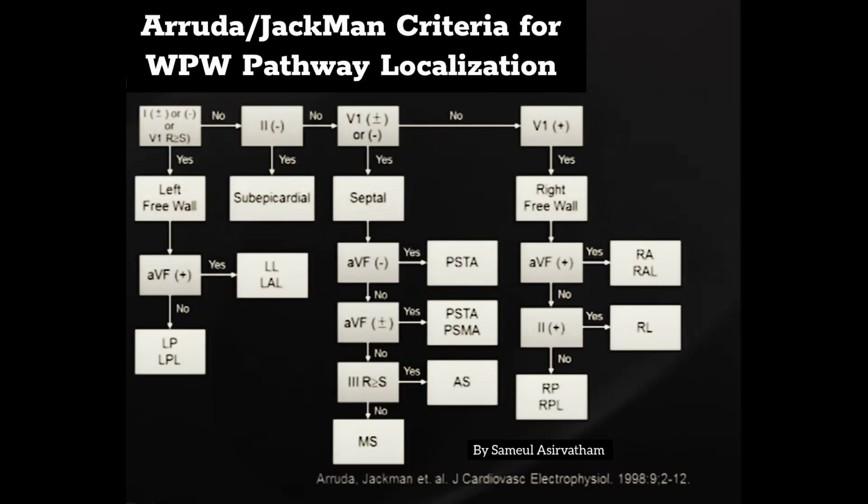And you can break this algorithm down into a few steps. How I like to think about it before going to the lab is, let me first figure out if it's left free wall. Left free wall connotation to me is you need transseptal. It's not going to be very difficult. Let's get the right sheath to put the contact correctly, and we should come home without too much problems.